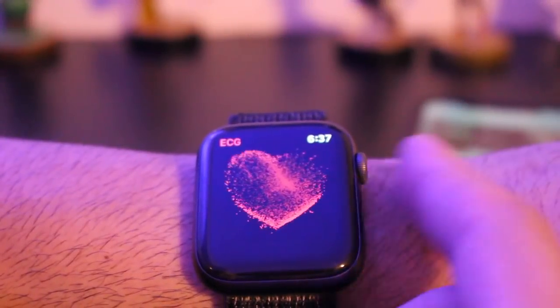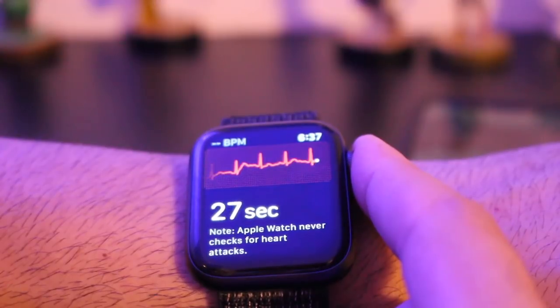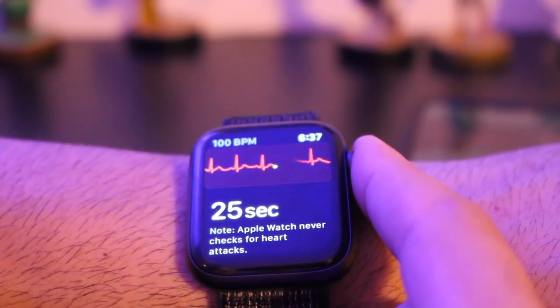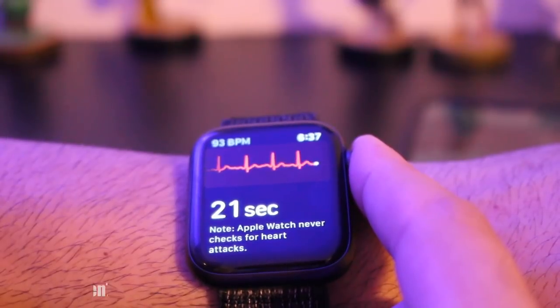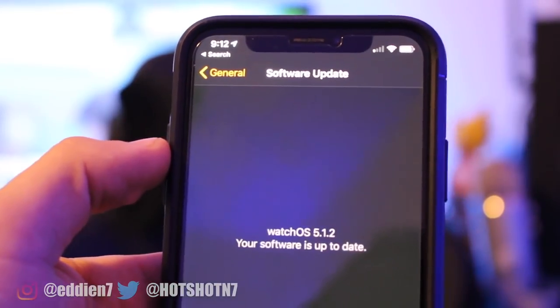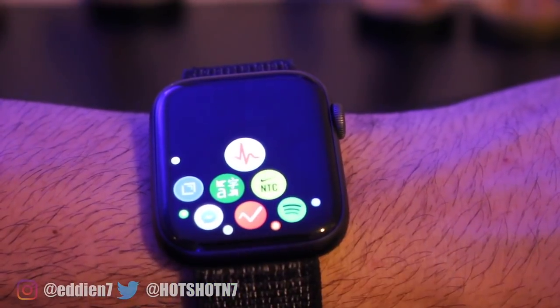Hey, what is good everyone. For this video I'm gonna go over how to enable ECG for your Series 4 Apple Watch. So if you recently updated your Series 4 to the latest firmware, watchOS 5.1.2 or newer, you may have noticed this new app — that's the ECG app.